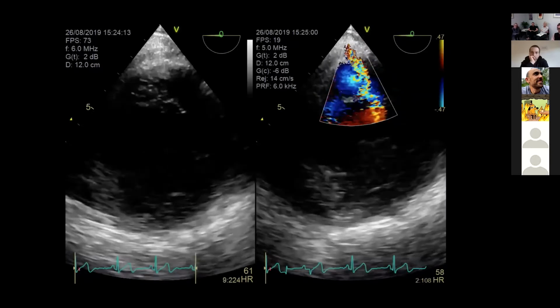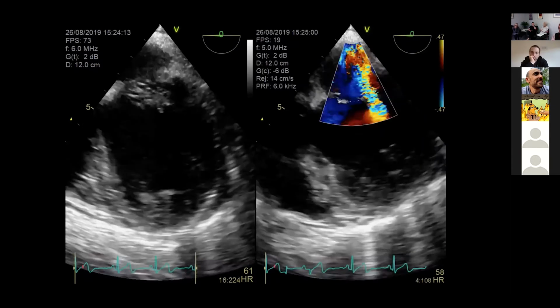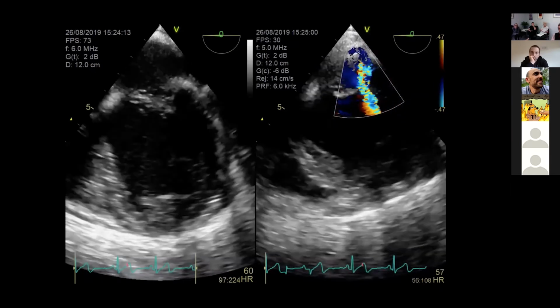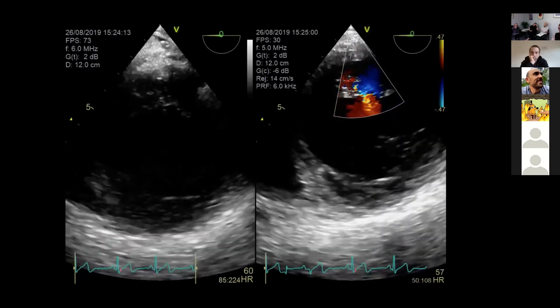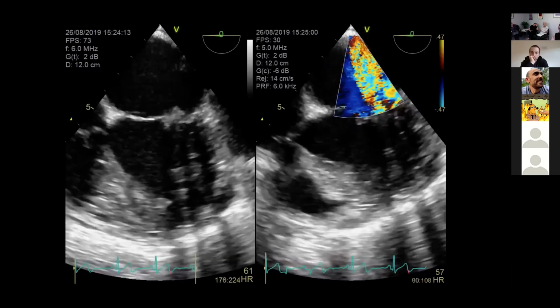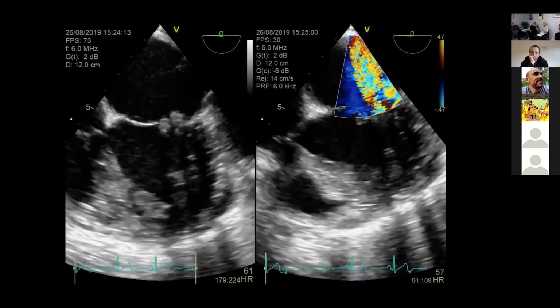The interesting thing is the nature of those masses, and I guess this is where you're trying to hone in. They are abnormal masses in a person who's got an abnormal mitral valve, and it's kind of interesting. You're quite right, it just goes to show you have to look at a number of parameters. If you looked at the gradient across the mitral valve, you'd be thinking about moderate to severe mitral stenosis. But when you look at that, it's not at all.